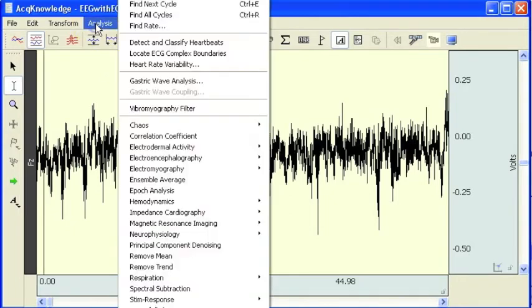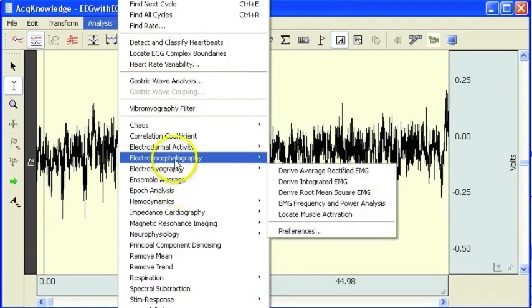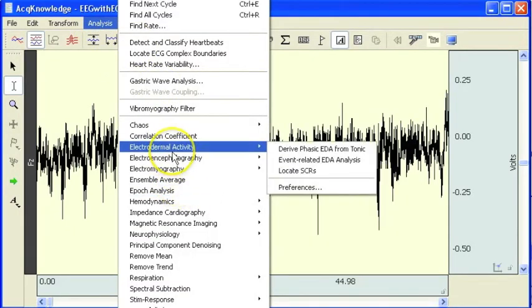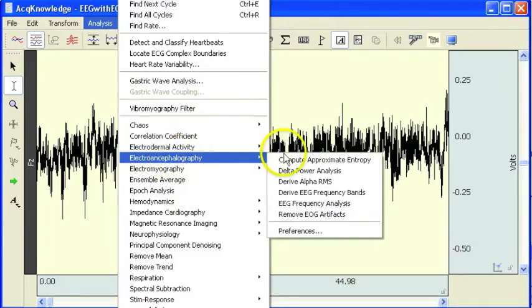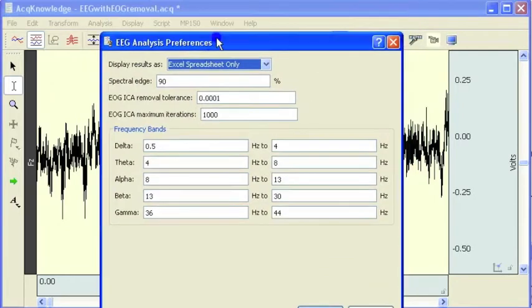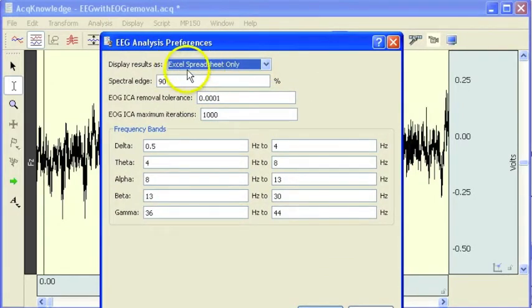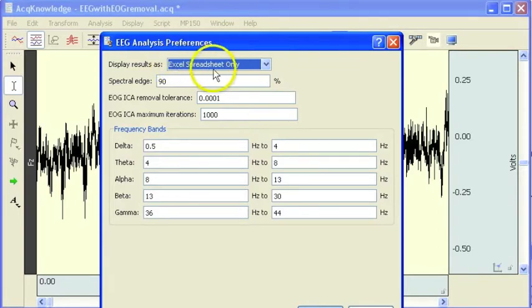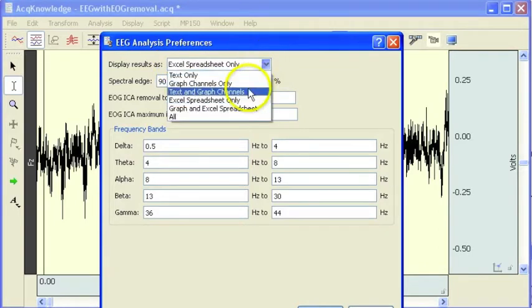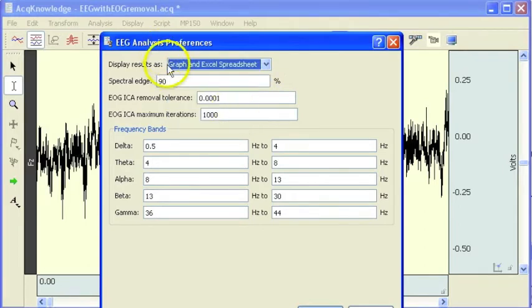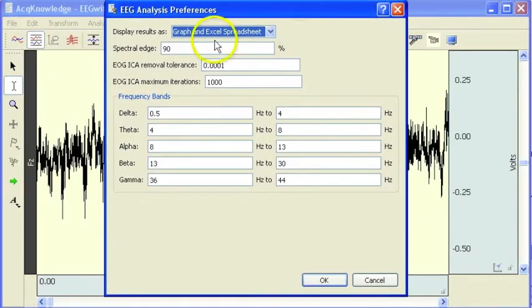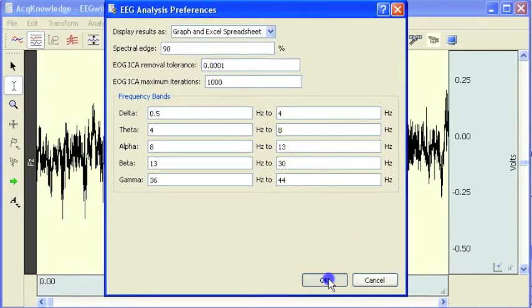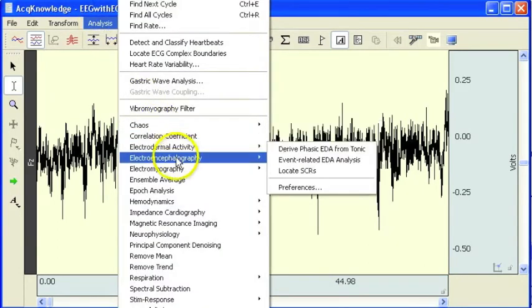If we go into the menu again for EEG and select preferences, this was set so that we were just going to extract the values into an Excel spreadsheet. We can select an option that will graph those measurements as well as export them into Excel. So I am going to re-run the analysis, do exactly the same thing again.